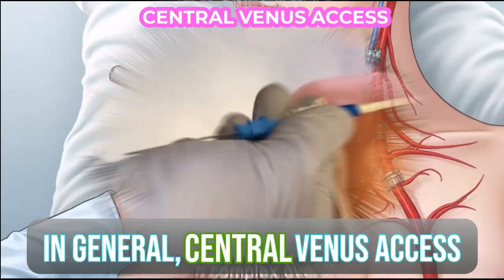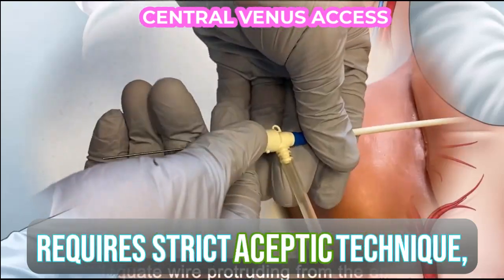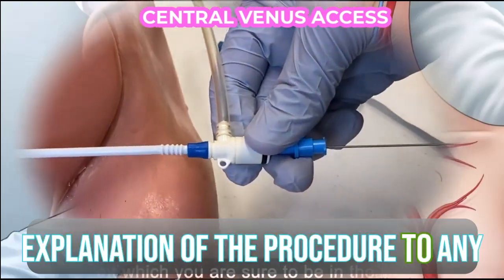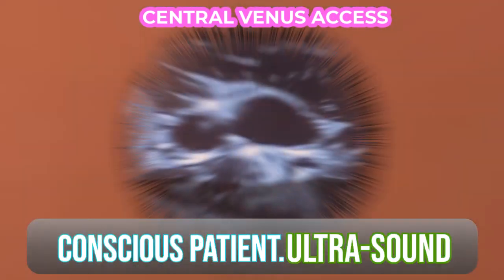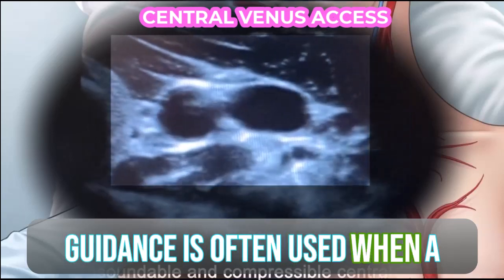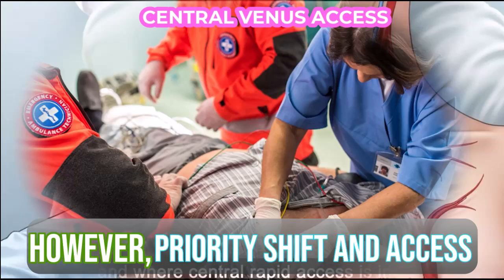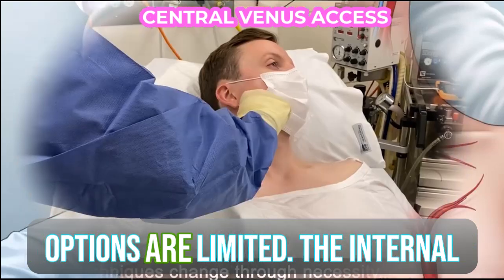In general, central venous access requires strict aseptic technique, proper patient consent, and explanation of the procedure to any conscious patient. Ultrasound guidance is often used when a compressible central vessel is available. In major trauma, however, priority shift and access options are limited.